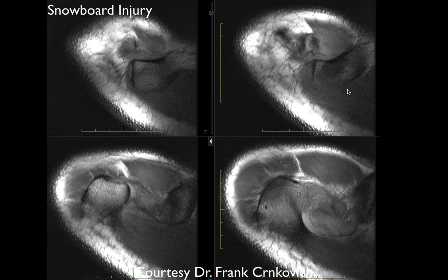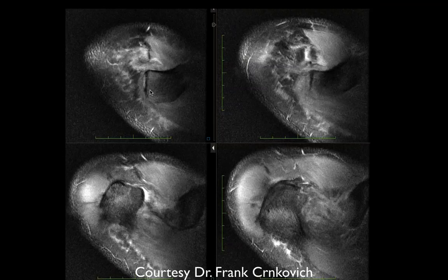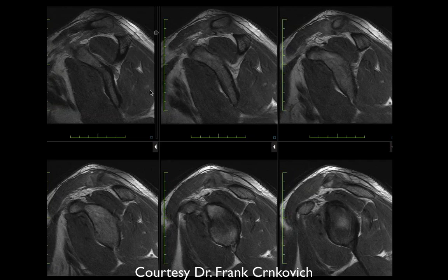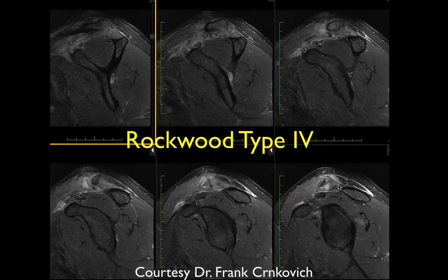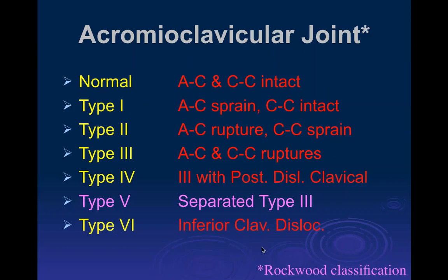In this snowboard injury case, multiple axial T1 images show the clavicle posteriorly and superiorly displaced with respect to the acromion. PD fat-saturated images show edema at the distal clavicle and acromion. The clavicle is both posterior and slightly superior, making this another Type 4 — a posterior dislocation of the distal clavicle with respect to the acromion.